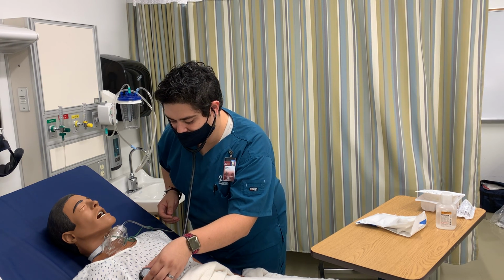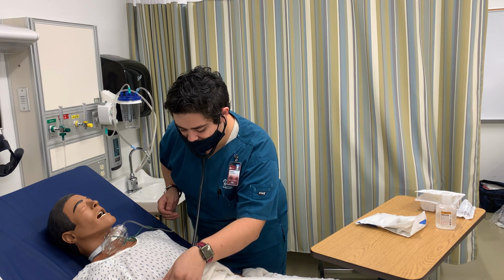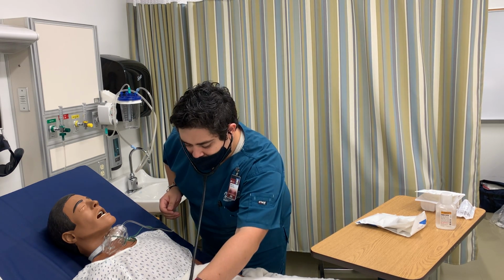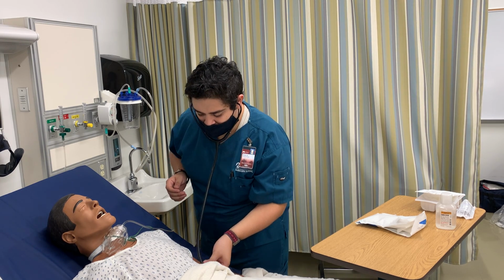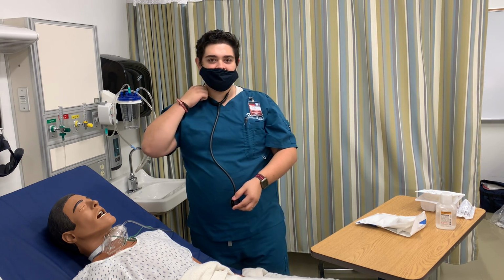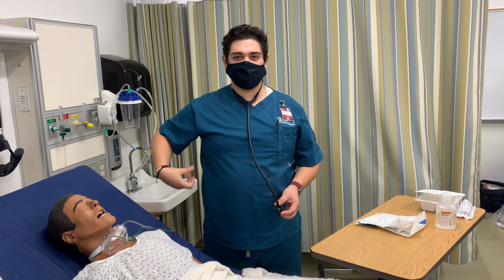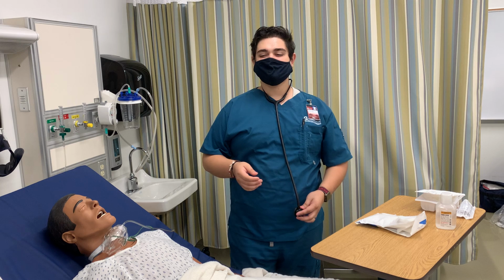Breathe in. Breathe in. Okay. Now what I did is I did do a full respiratory assessment on the anterior, lateral, and posterior sides, but as simulated.